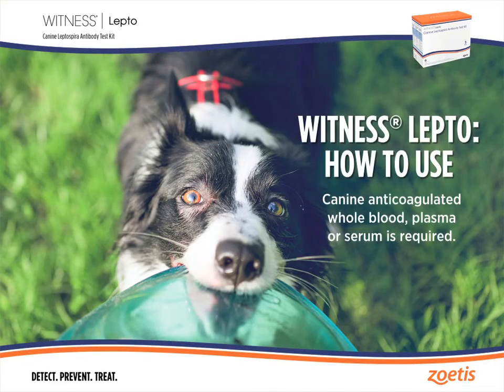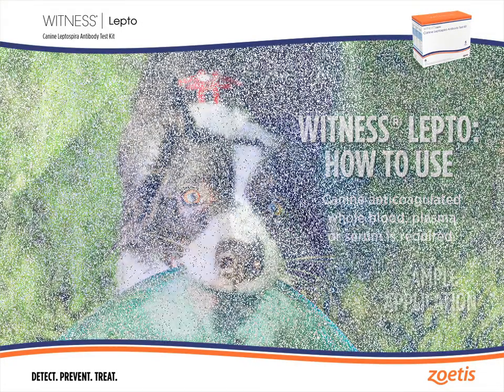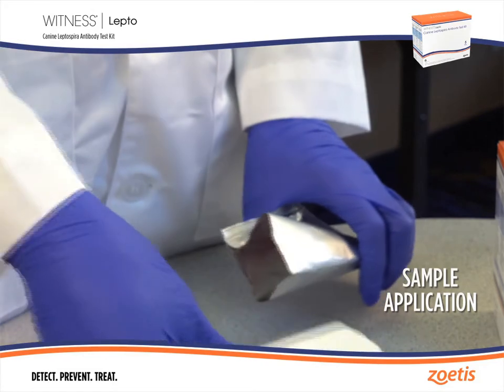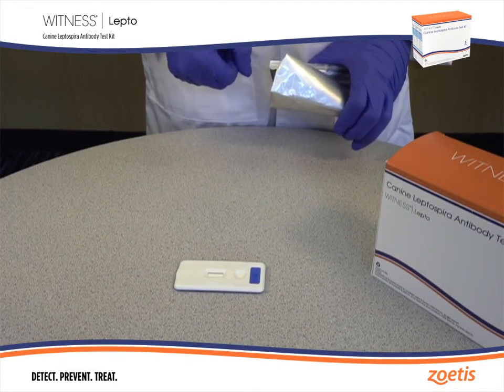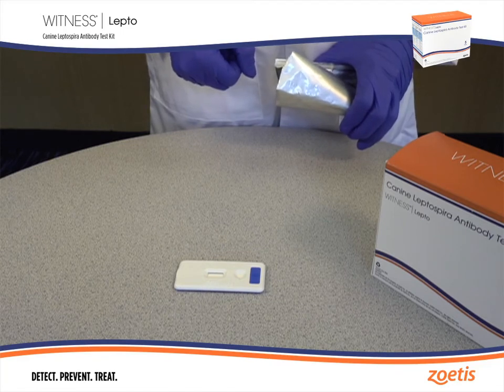Canine anticoagulated whole blood, plasma, or serum is required. Tear open a pouch and place the test device on a flat horizontal surface. Please note that the test must be performed within 10 minutes of opening the foil pouch.